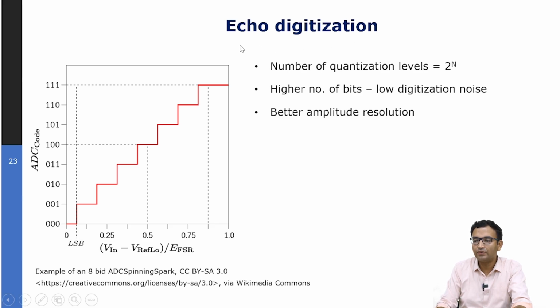As you may have read previously in topics related to communication theory, when you have a signal, you are able to convert it to a digital signal by 2 processes. One is sampling and the second is quantization. Sampling will make the signal discrete along the time domain, and quantization will make the signal discrete along the amplitude axis.